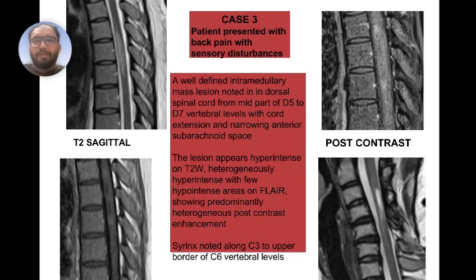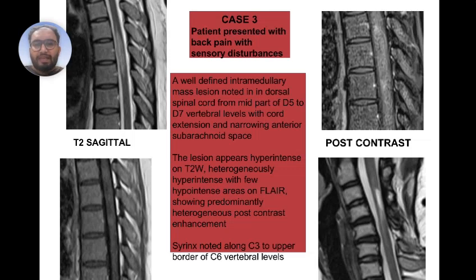Case 3: A patient presented with back pain and sensory disturbances. A well-defined intramedullary lesion is seen in the dorsal spinal cord from mid D5 to D7 vertebral level with cord expansion and narrowing of the anterior subarachnoid space. The lesion appears hyper-intense on T2-weighted images, heterogeneously hyper-intense with few hypo-intense areas on FLAIR, showing predominantly heterogeneous post-contrast enhancement. A syrinx is noted along C3 to the upper border of C6 vertebral level. Thank you.